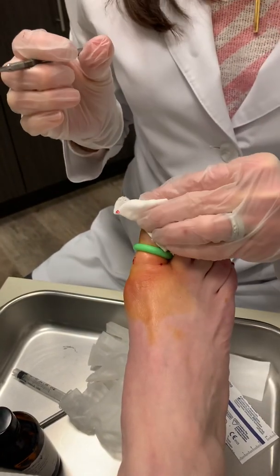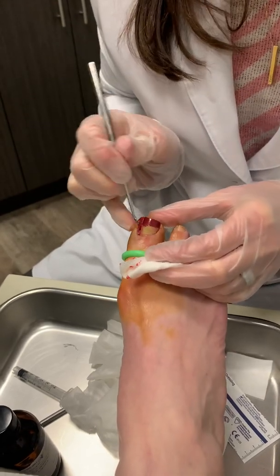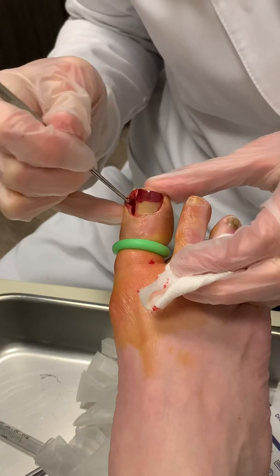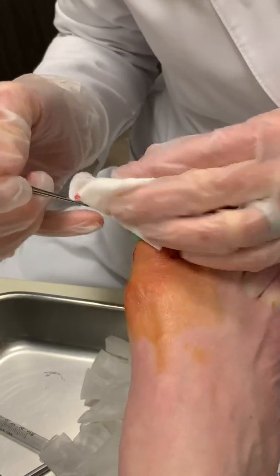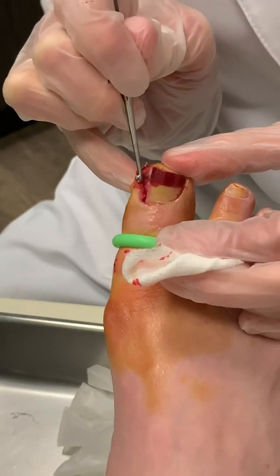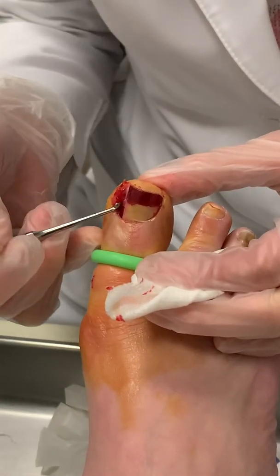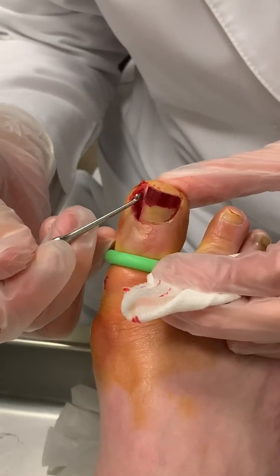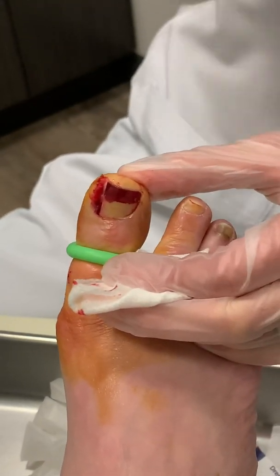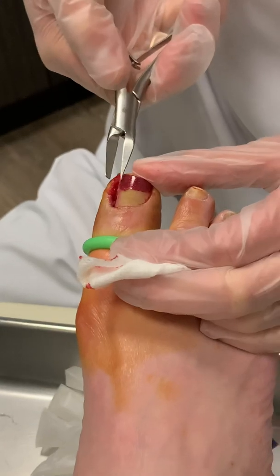Then you take a curette, and that's what allows me to scrape the nail edge and make sure I don't feel any remaining nail underneath there. In this patient, she actually had developed kind of a skin flap — that's just really, really inflamed, aggravated tissue — and so I'm also going to trim that off so that doesn't become a bigger problem.